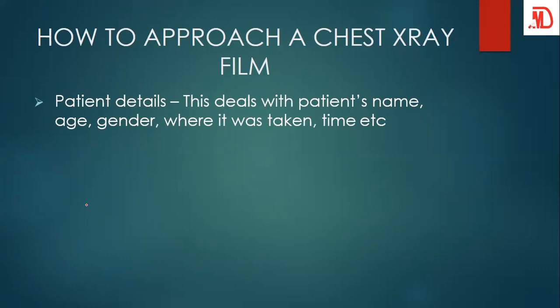And the next thing that you have to do is to check for the quality of the film. Quality is important in the sense that if the film is bad, you might end up getting wrong diagnosis. So it's good that you have a good film. It's not every place that you do your x-ray. Some physicians will tell you to go to a particular place, because they believe that these people give them a very good quality film. So it's not everywhere that you have to request for x-ray. Go to a facility or a private place where they do quality film.